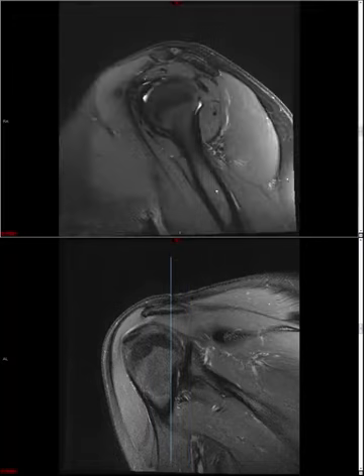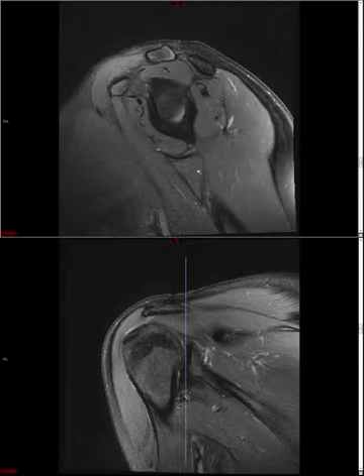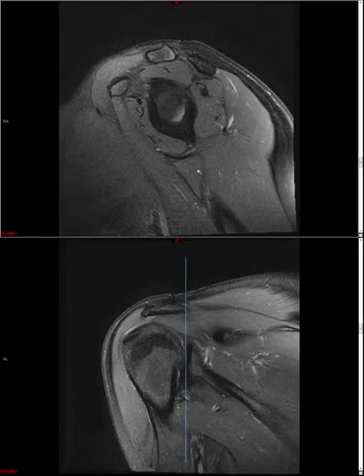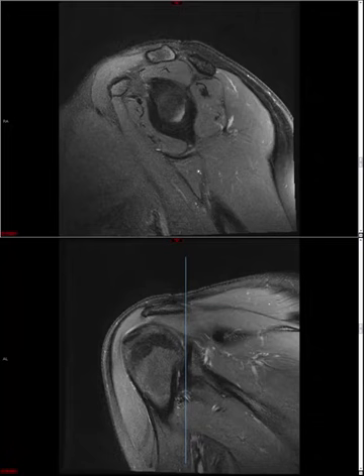Getting to the actual case, the checklist I follow for shoulder MRI includes the rotator cuff, then the acromion, the AC joint, and acromial morphology. I look at the subacromial bursa and other bursae, then the glenohumeral joint, and then the glenoid labrum.